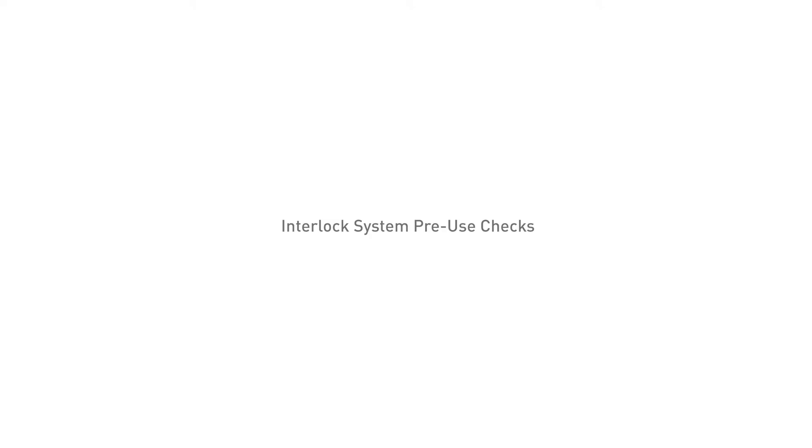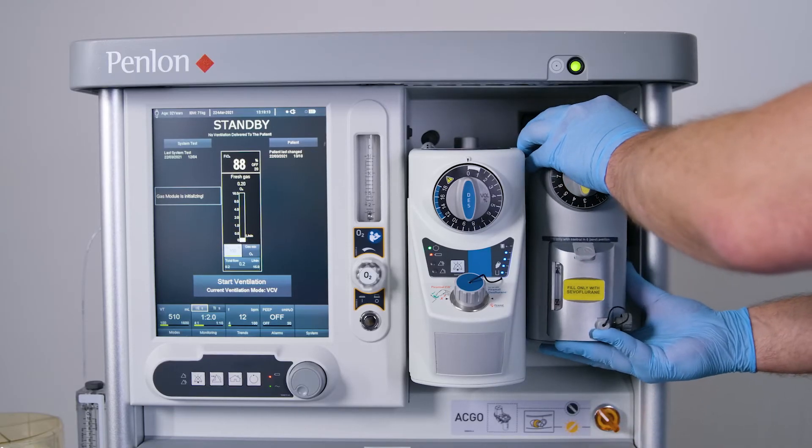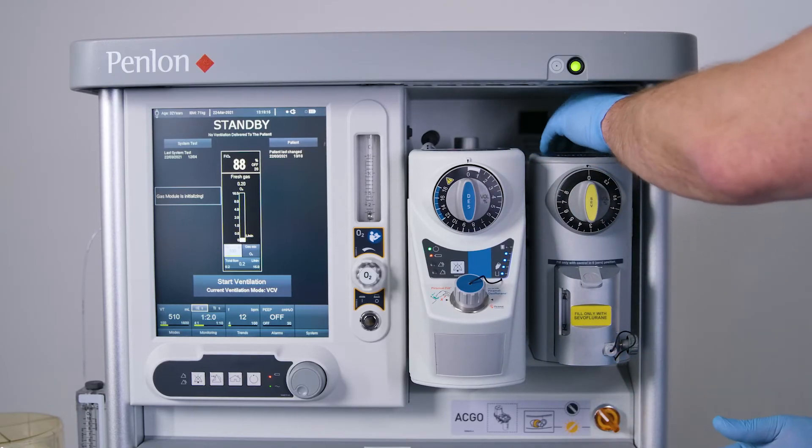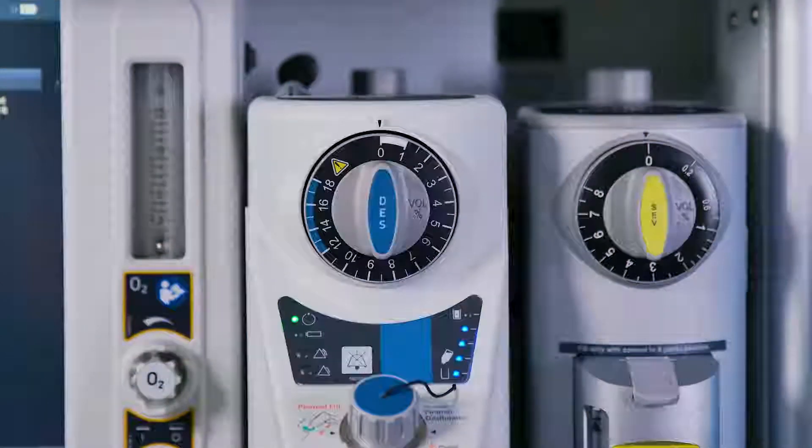Interlock system pre-use checks. Mount another vaporizer on the machine back bar adjacent to the Sigma EVA. Allow the Sigma EVA vaporizer to finish warming up and enter standby mode. This is indicated by the power indicator being continuously illuminated.